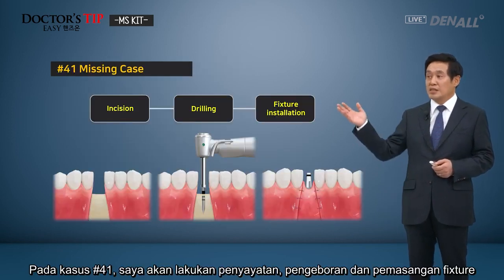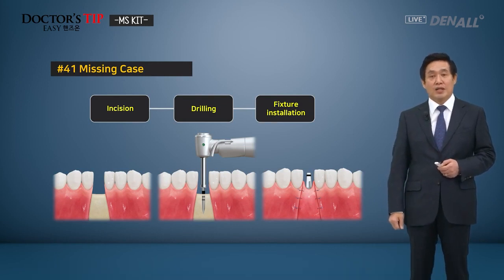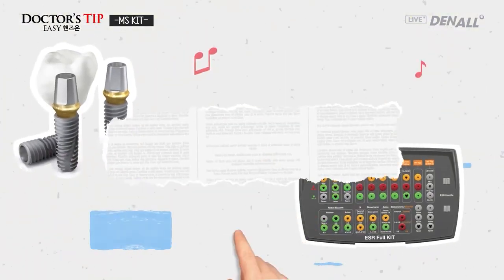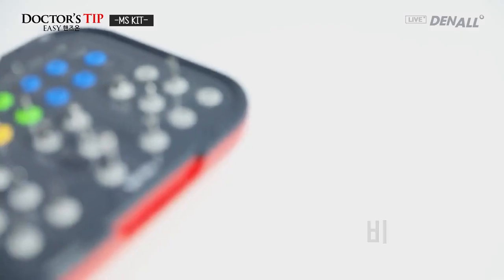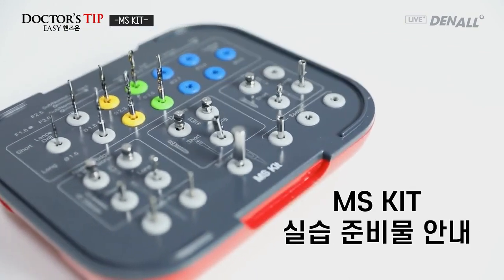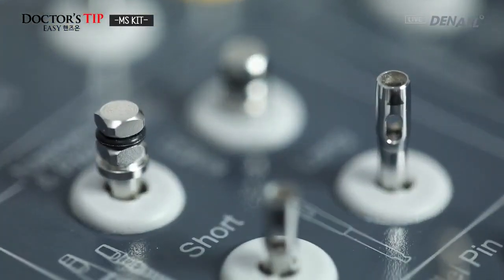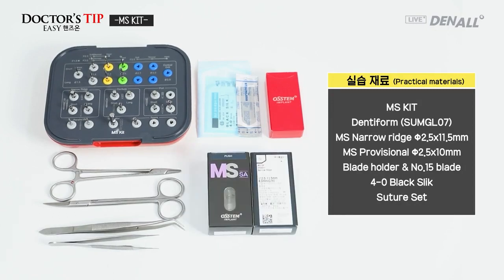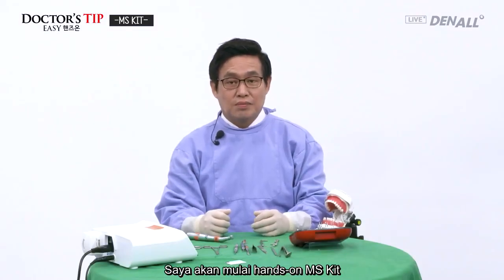So this is the case. 41 is missing. For that case, first I do incision, drill, and then the MS fixture will be installed. I will see you in hands-on practice. So now I'll do hands-on for the MS Kit.